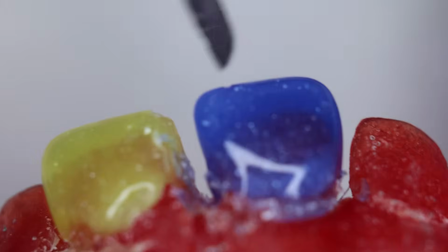It usually comes in one segment. So done. So these parts of the crown are removed.